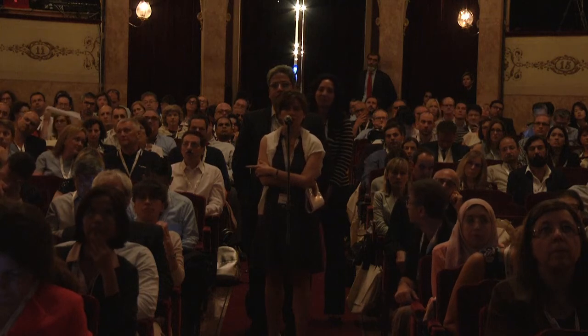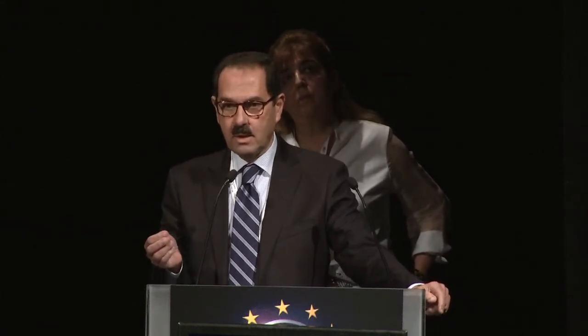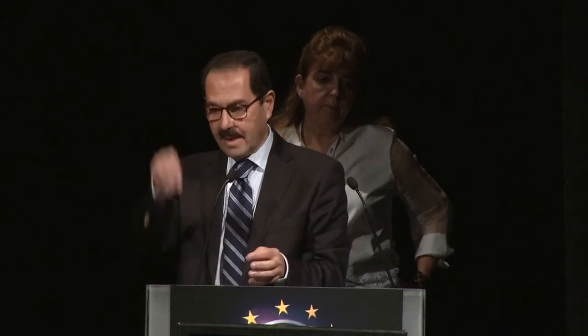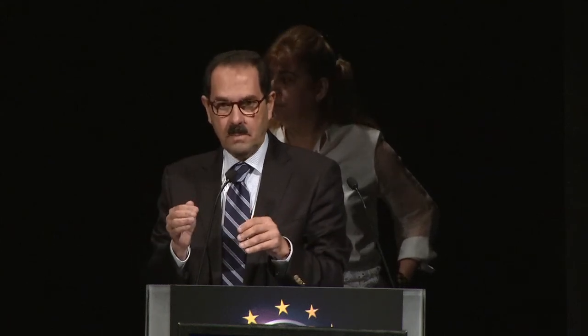Hello, I'm Leonardo from Argentina. Did you drain the subretinal fluid in retinal detachment, and when do you choose silicone oil? We have two types of detachment associated with macular holes: those filling only the staphyloma and those reaching to the ora serrata or periphery. For those filling the staphyloma, you don't have to drain — if you try to drain, you will suck the flap into your flute needle. You inject air and place your flute needle at the optic disc with the aspiration port directed away from the macula, perform air-fluid exchange, and with the patient face-down on postoperative day two, the retina is attached.